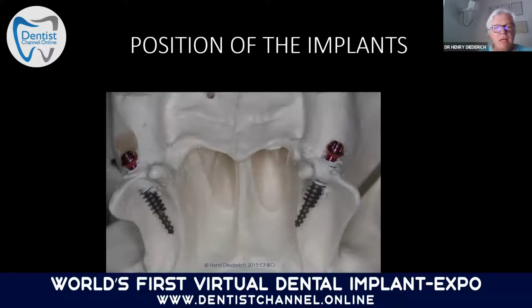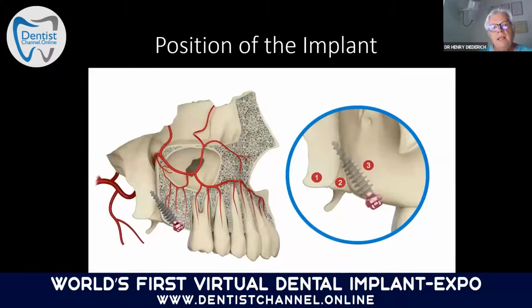What will happen with time? Bone will grow around this implant because, you know, osteoblasts are in love with titanium, and there will be an osteointegration, and that is so strong anchorage you cannot take it out anymore after. And then you see, don't be scared, because of course, if you want to put the pterygoid implant, you have to know the anatomy, you have to know the know-how of this placement, and it will be really an added value for your daily practice in implantology, which may avoid sinus lift and another time bone graft.